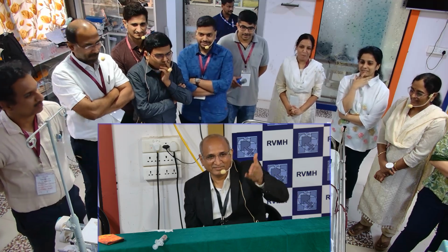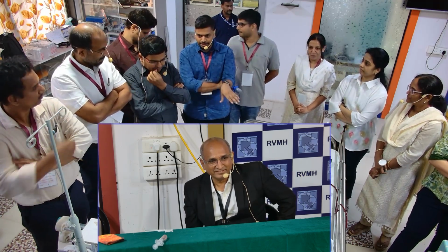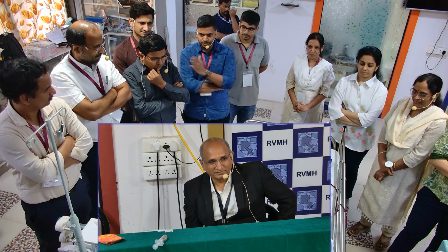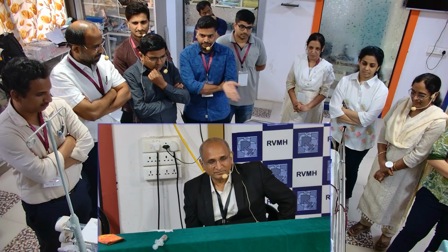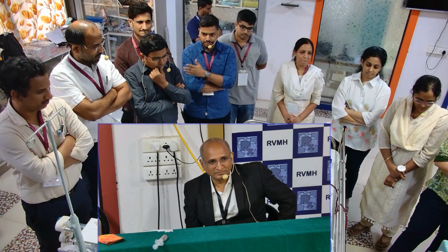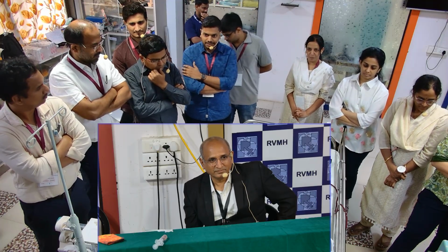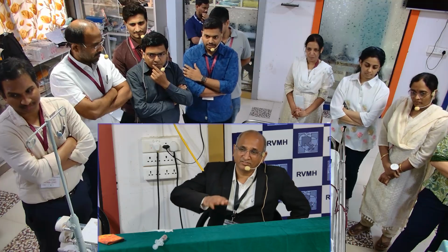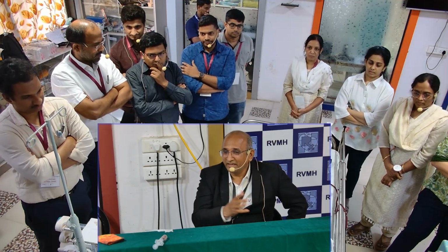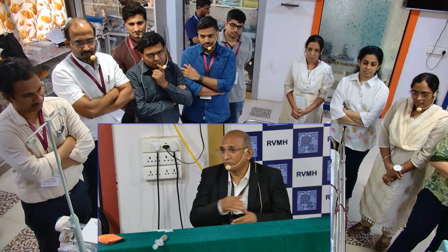Like in the beginning, we got to know that the problem was in the machine, with the tubings being the same color. Then we again went to the patient side, thinking of that. So if we go systematically, it will be better. If in the first place itself we knew that the problem is in the machine, then finish off the machine thing, then go to the patient. Or at the same time, the other team will be assessing the patient. If any problem is there, they will tell. So the machine-related team should focus on the machine, and the patient-related team should focus on the patient. Then also things would have made a difference. You would not have gone to and fro.